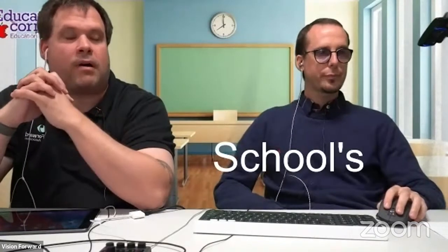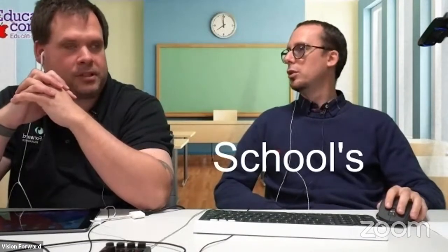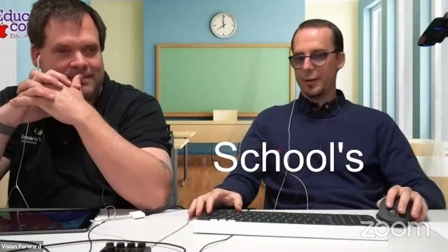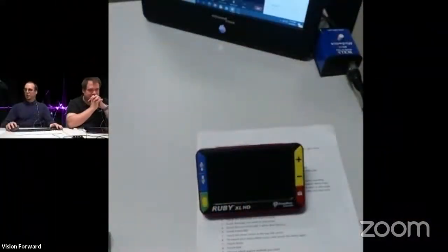All right. Do we have anything else we need to say at the top of this? I don't think so. I think we got a lot to cover. We got tons of devices today, so maybe we just dive right in. Let's dive in. All right. So we're gonna switch cameras here. Here we go.